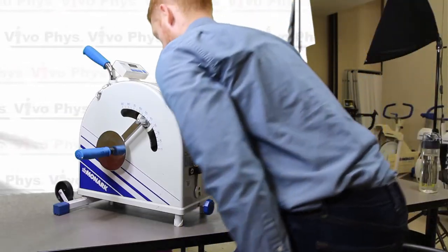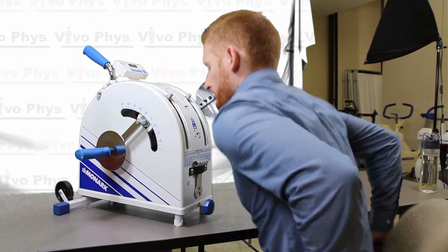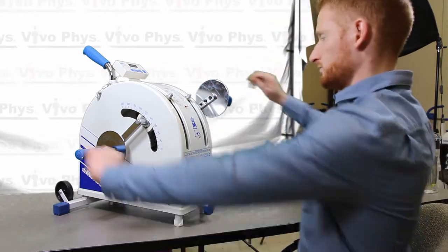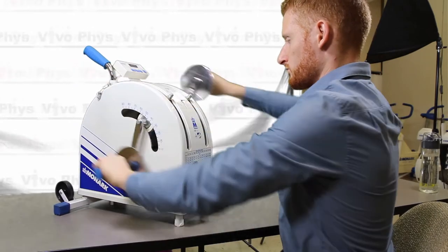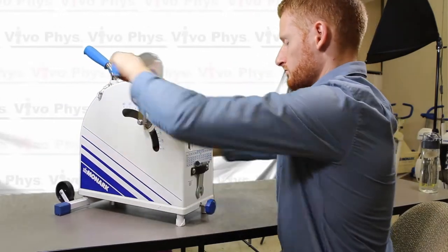Pull your chair right up to the table, make sure that it's square with the arm ergometer, and make sure that the arm ergometer is set up so that the axle is approximately at the level of the shoulder or just below that. You can adjust the height of the table if you have an adjustable table, or you can also adjust the height of the axle on the arm ergometer itself.